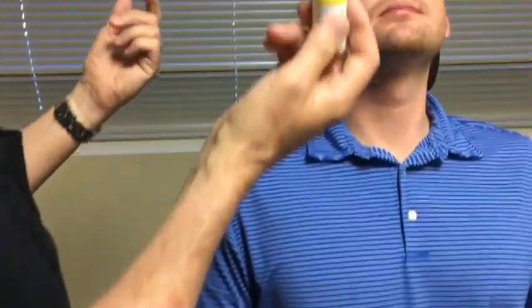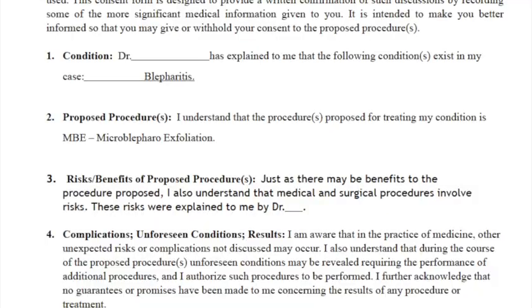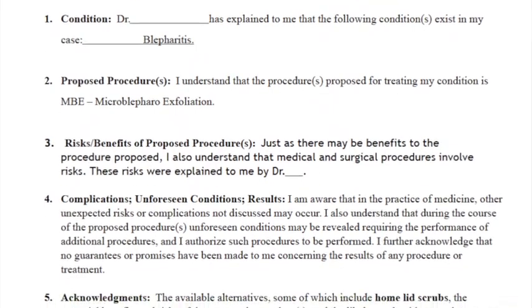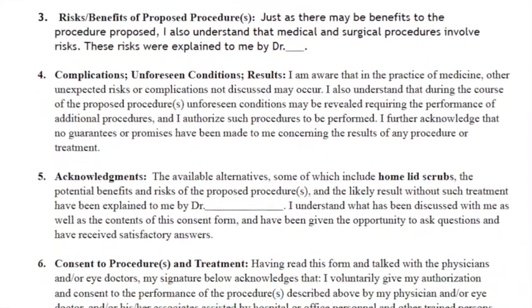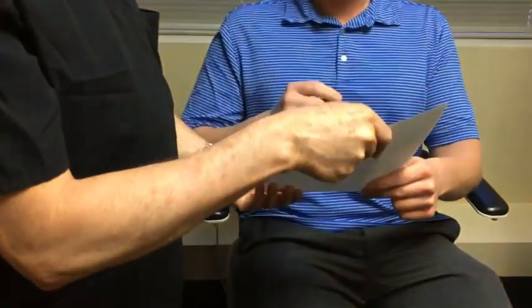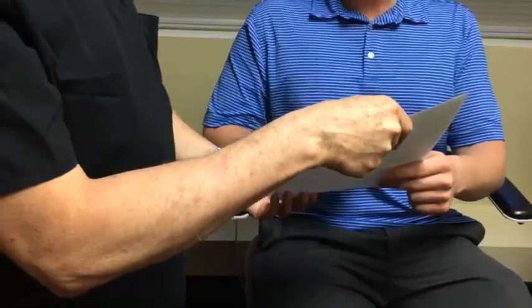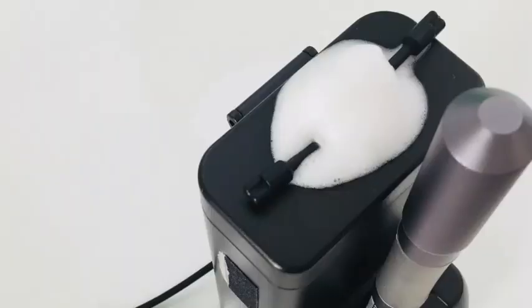And have the patient look up at the ceiling and just drop a numbing drop right in both lower lids, just like that. And then while those tips are soaking, and you want them to soak for about a minute, you take your consent form and you have a patient sign it. And the consent form is included. Second set of numbing drops because many times, as you know, your patients will tear out the first drop because it slightly burns and stings.